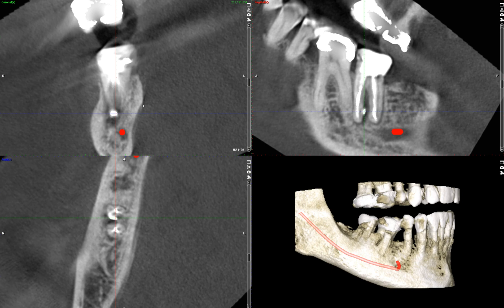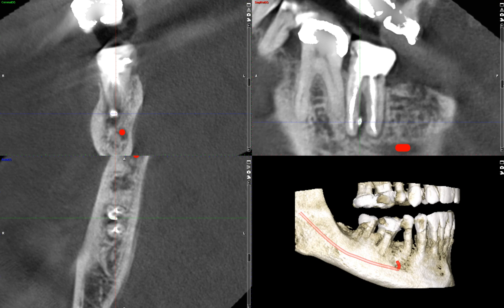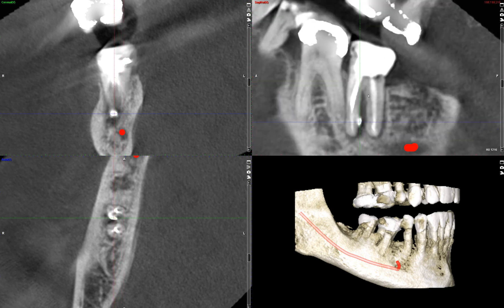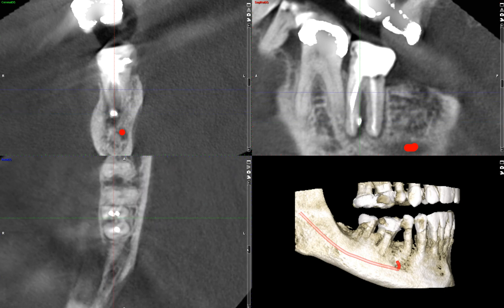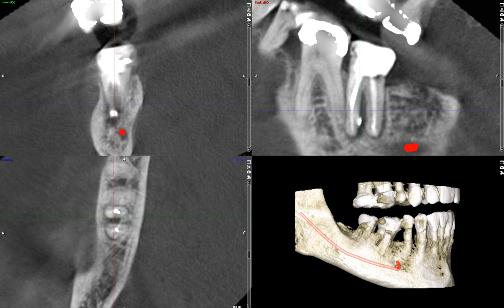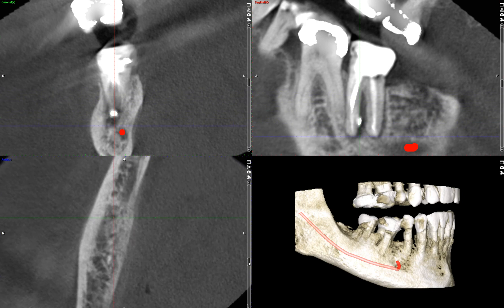So how did it get there? Obviously I don't know the full surgical or dental history in this case. Another feature that many of you may have noticed is that we have a lot of bone loss along the mesial root involving the furcational bone. This shows very severe bone loss along the mesial root — starting from the furcational region and extending all the way down to the root apex, visible in the axial view as well.